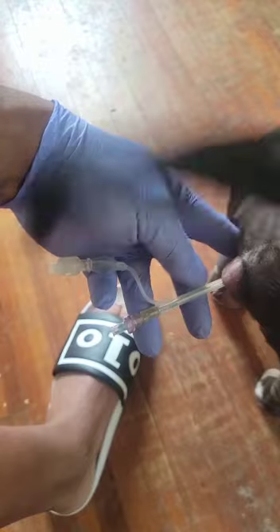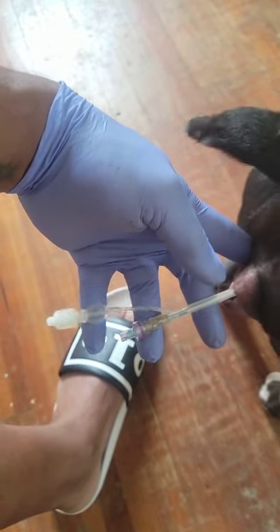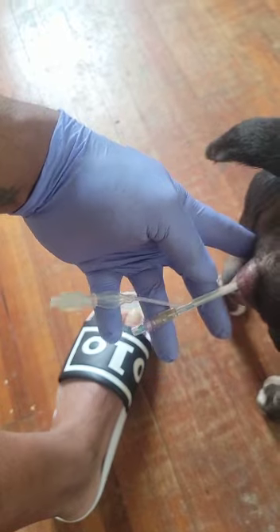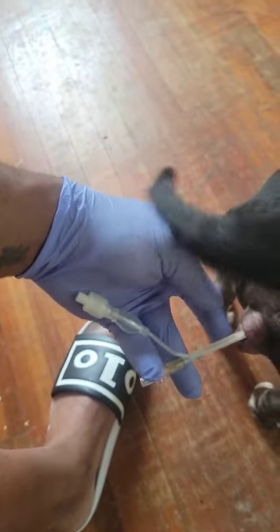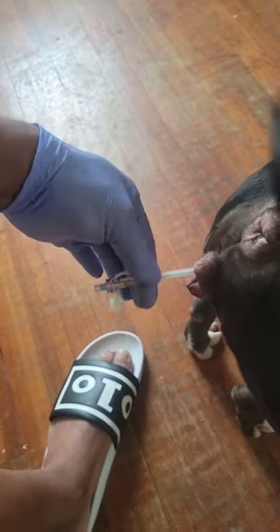After you push the semen in, you put the syringe on the part of it and flap it around. And you push the air in it and it locks — it becomes like a nut, like a ball sack. And it locks up in the air; it can't drop out, it can't pull out.